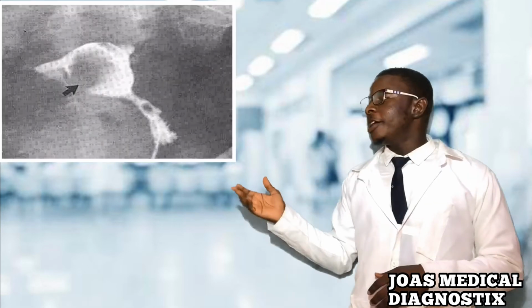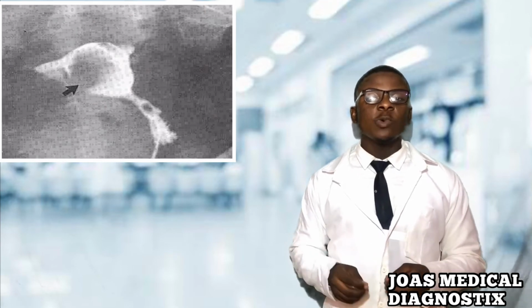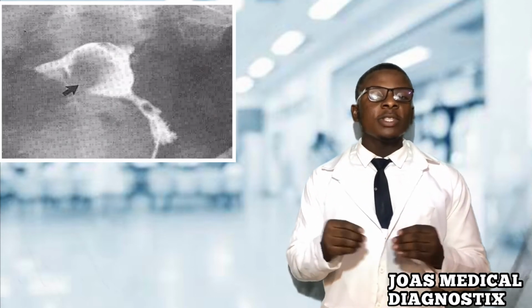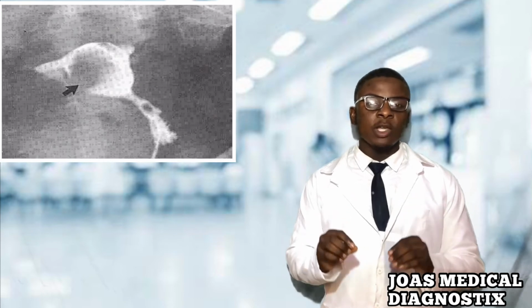that has been associated with infertility or subfertility. Here is an image of an HSG with a lot going on. First, we see that the uterus is deviated towards the person's right side, or towards your left side. We also don't see any dye going into the fallopian tubes, but most importantly, we see an area of the uterus in which no dye is seen. This represents an intramural fibroid.